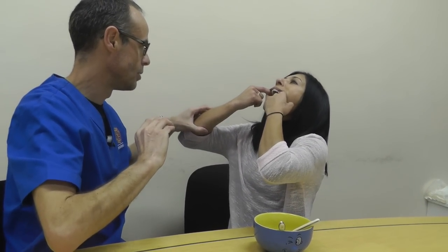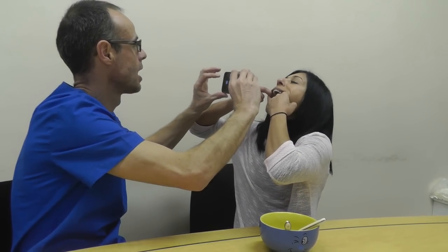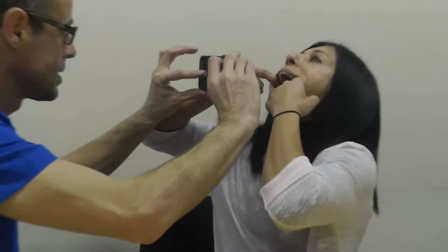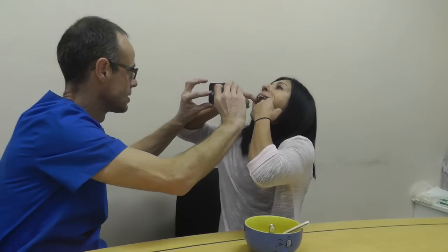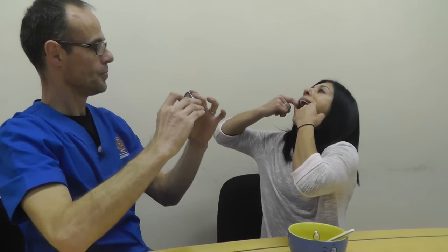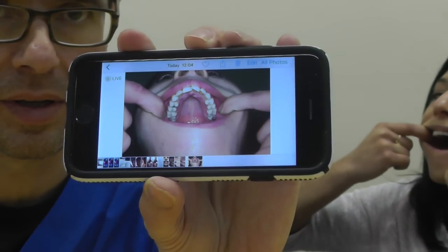Open a bit wider — open wider, open wider. Try and keep that down as far as possible. It's a photo, and of course to take the lower occlusal would just be a repetition of the same thing. In that way, you can take reasonable clinical photographs at home without complex equipment.